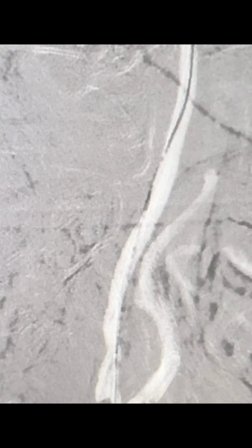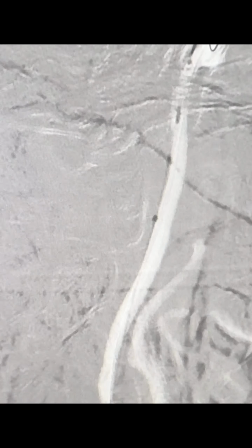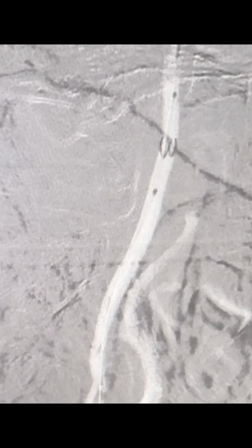which is a device which protects the brain from having a stroke during this carotid artery stenting procedure. The deployment of this device makes this procedure very much safer, and this umbrella-like device you can see in between two dots. This is the embolic protection device. So now we have to take the stent across the lesion.